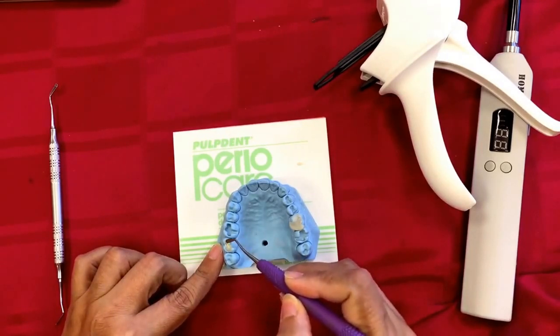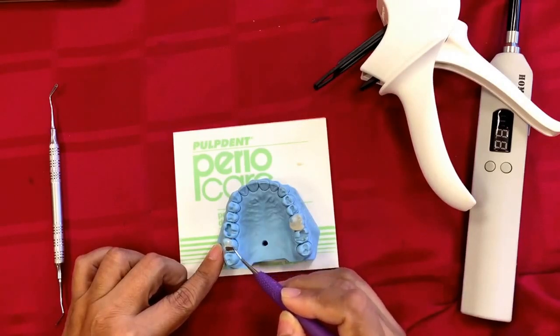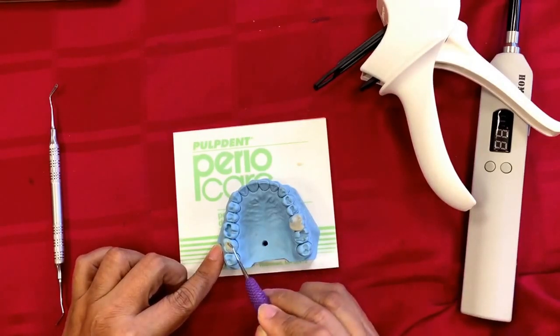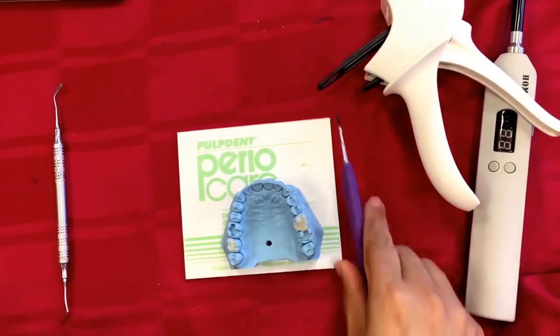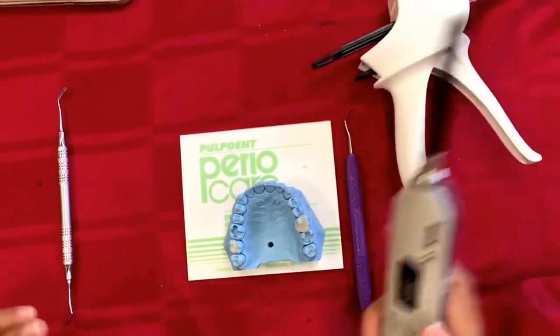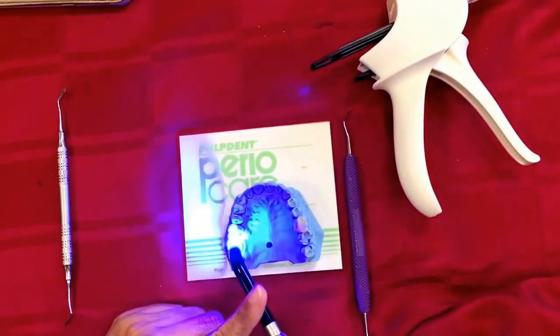You can shape out the occlusal anatomy to some extent — spread it on the occlusal enamel bevels created during the prep, and to some extent you can create the transverse ridges and some basic occlusal anatomy. Once 20 seconds have elapsed, shoot for 20 seconds of light cure.